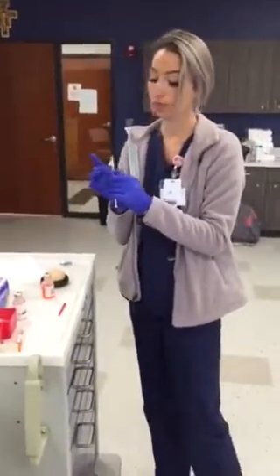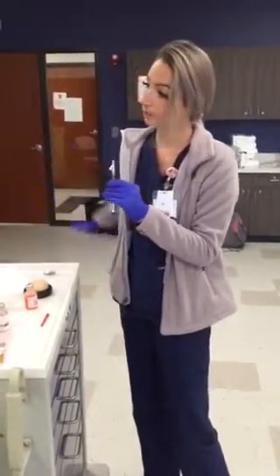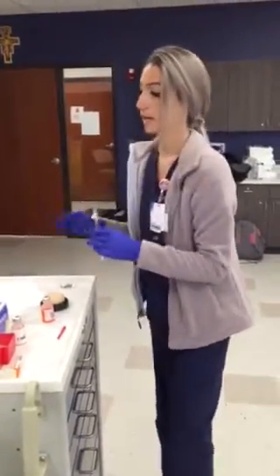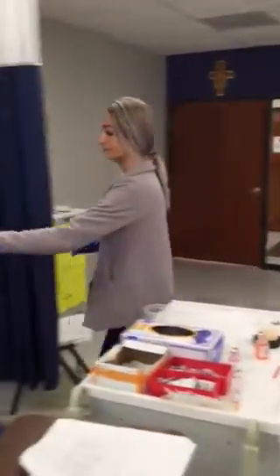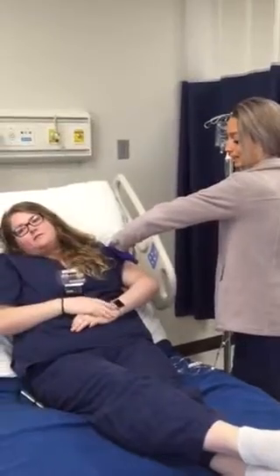So the vitamin B12 is an intramuscular injection. Would you like it in your glute or in your deltoid? My deltoid. Okay, so again, I would be over here. I'm feeling for her landmarks. Okay, so I'm going down here. I'm going 3, kind of making a zigzag down.